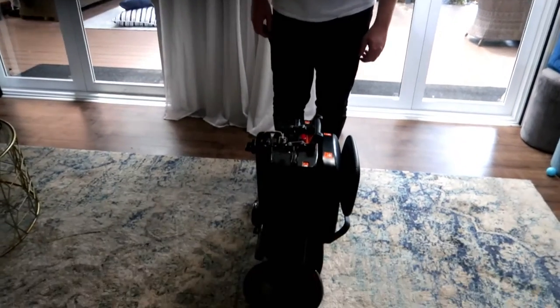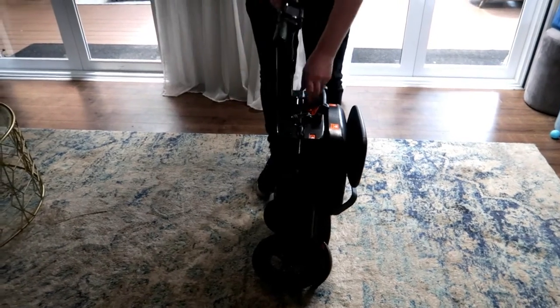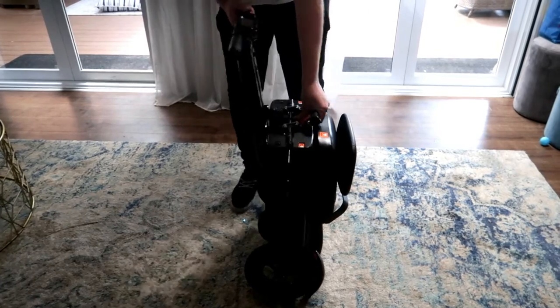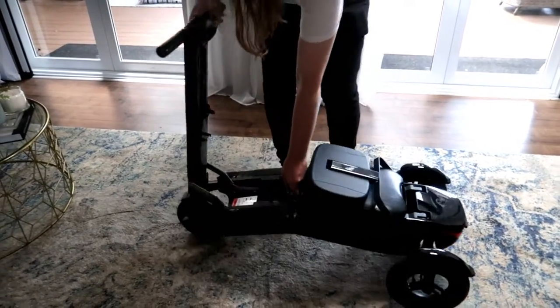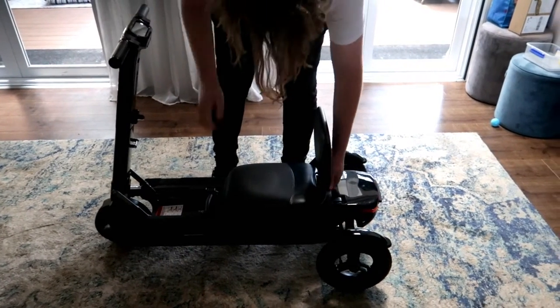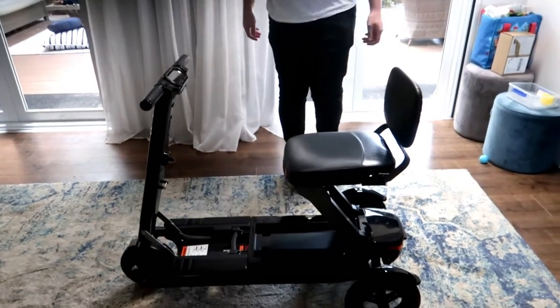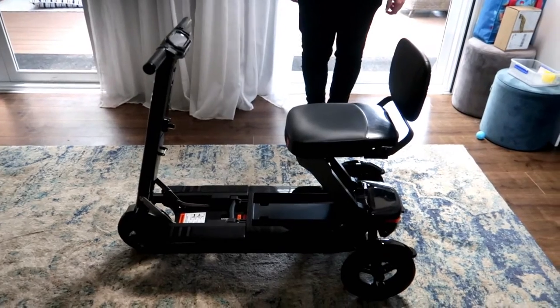Josh is going to show us how to open up Pa's new scooter — super easy to unfold. Lock in the little handlebars first, then push this little red button and it folds out and locks into place. Lift up the seat from the back, not the front, and there you go — that easy. Now Pa can jump on — give it the demo, hop on, start her up.